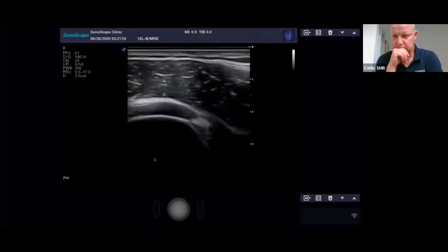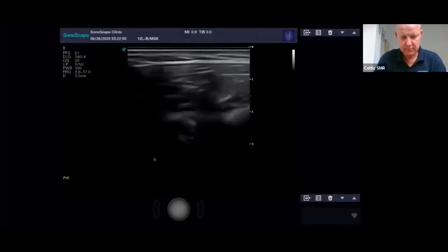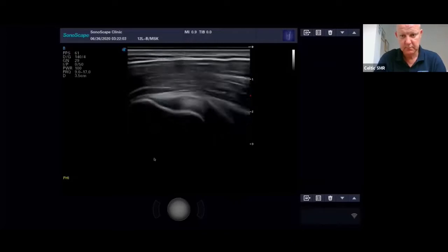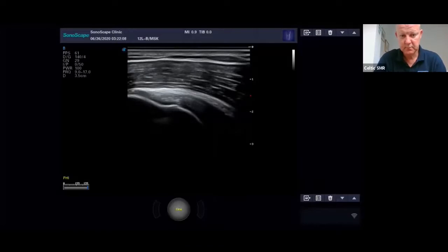Okay, I was going to go into how you describe your tear thickness. This would be the articular surface, and this over here would be the bursal surface. So if you get a tear that's basically just on this side, that would be a bursal surface tear, okay? And if it's on this side, it would be an articular surface tear.